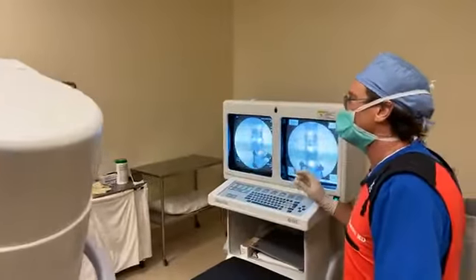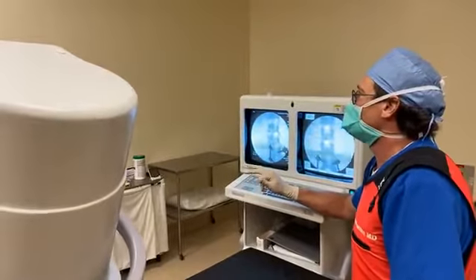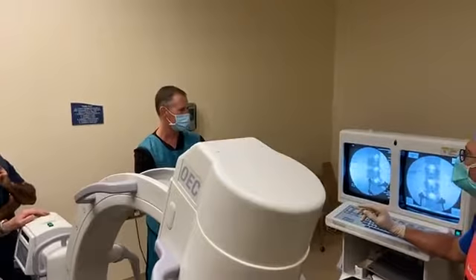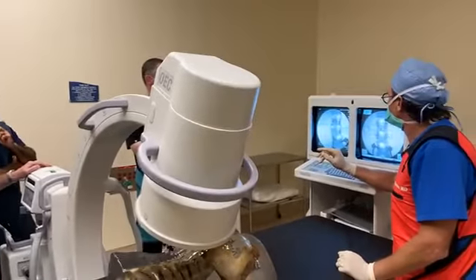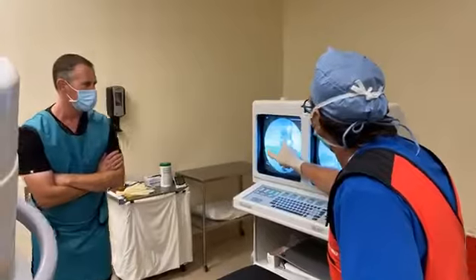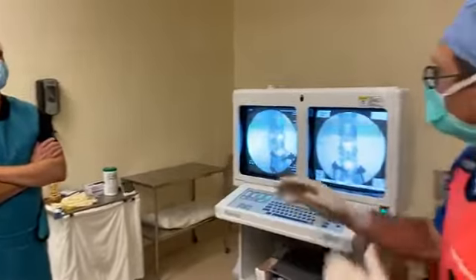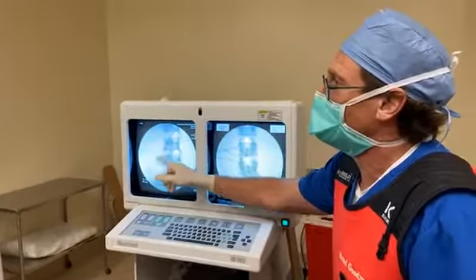Max, you had a question earlier that I had you hold. So go ahead, what was it? My question was, if you take just the most cephalad needle, is it up against the superior articular process? This needle here. Or either one? So this needle that's in the facet is actually wedged between the superior articular process and the inferior articular process.